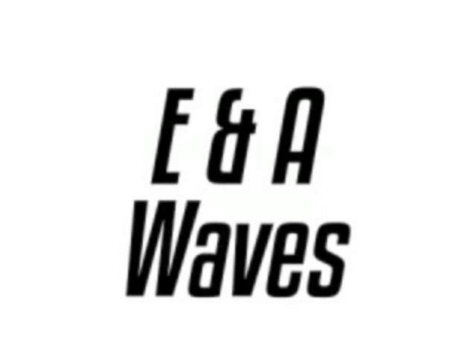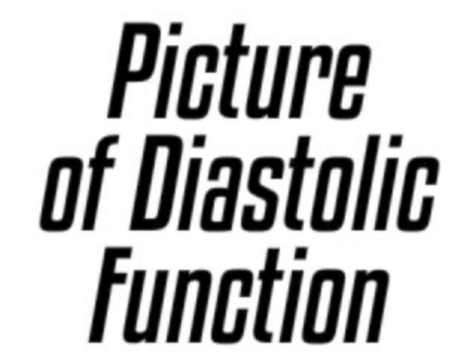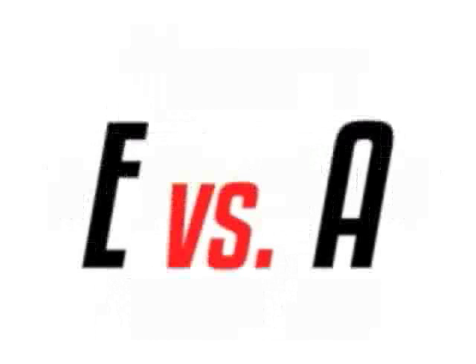So we are actually just a little over halfway through this entire talk, but there's no way we're going to torture you with 45 to 50 minutes of this. So just a quick recap of the last few minutes, what we went over. We had just talked about how the E and the A waves represent the velocity of blood flow through the mitral valve and give us a picture of diastolic function. E greater than A can be normal function, or E greater than A can represent pseudonormal function.